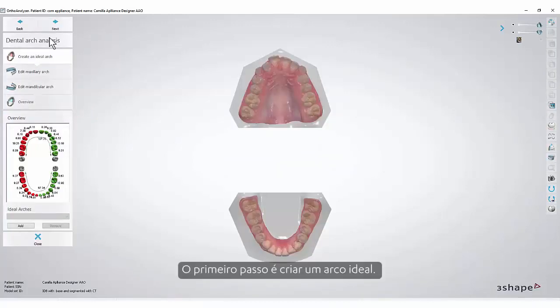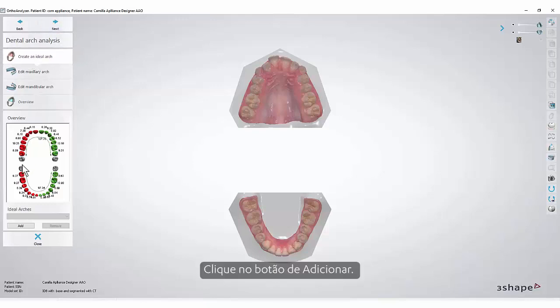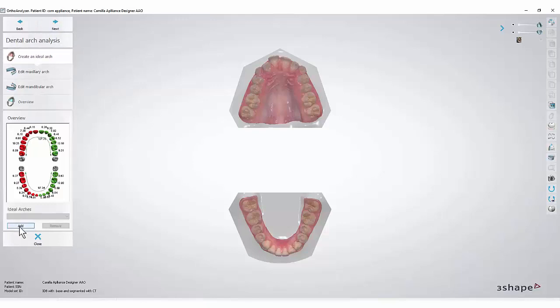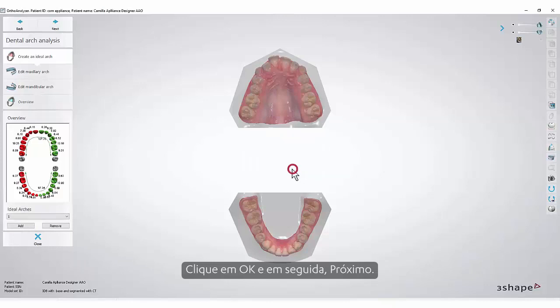The first step is to create an ideal arch. Please click the Add button. You can leave the date or you can, for example, write in the number of the arch. Click OK and then Next.